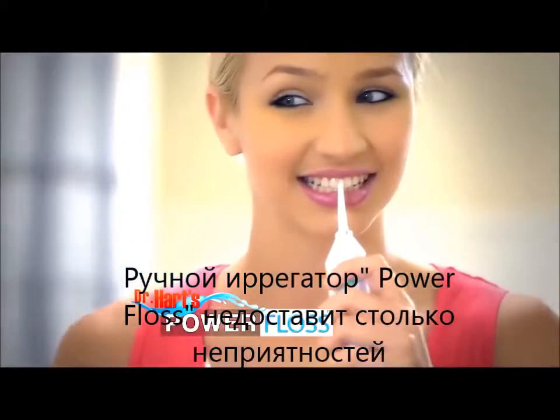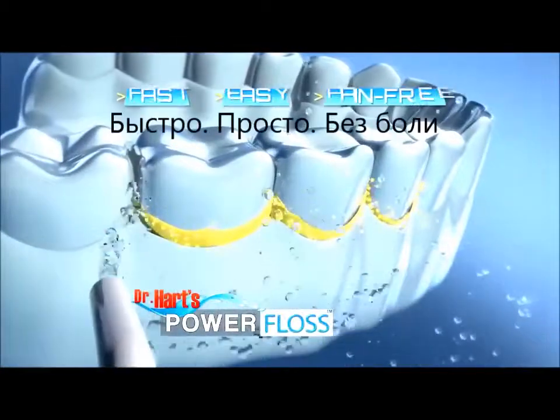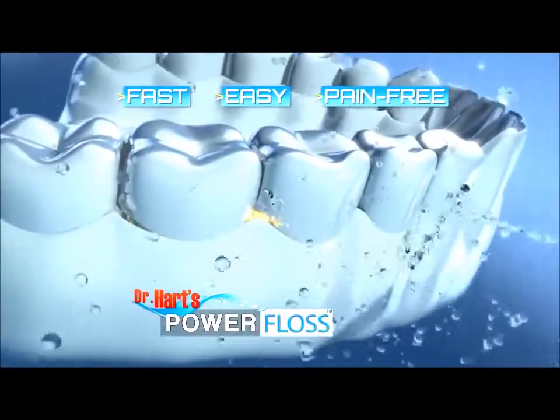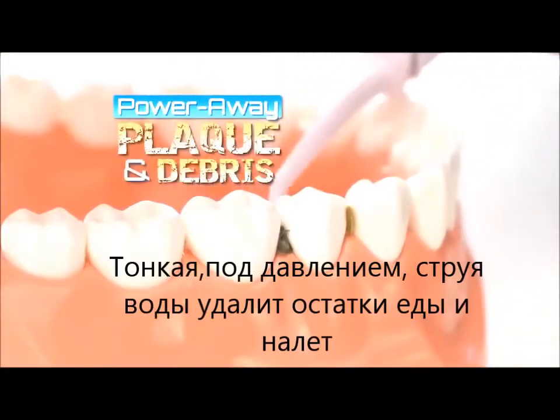Look, flossing your teeth doesn't have to be such a pain. Introducing Dr. Hart's Power Floss — the fast, easy, pain-free way to floss every day. Just fill, point, and press to power away plaque and debris.